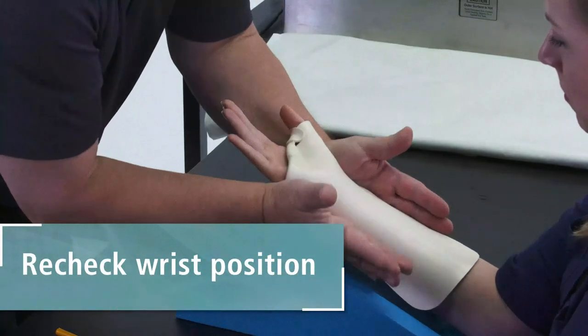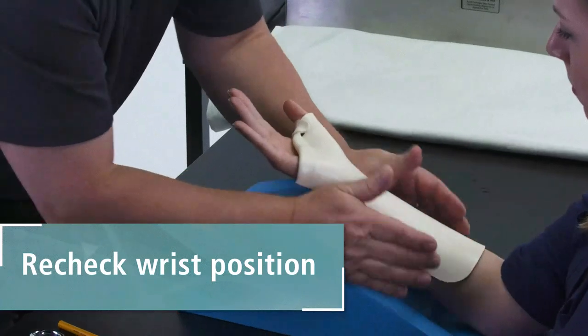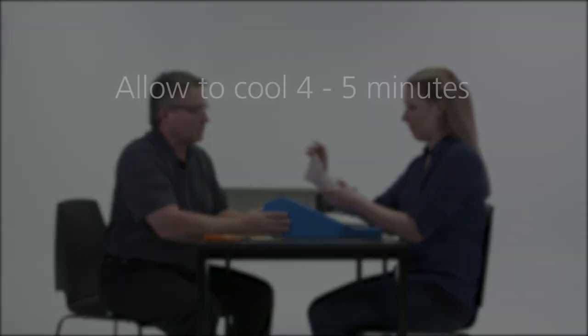Using open hands, gently stroke the wrist and forearm portions. Allow the splint to cool for 4-5 minutes.